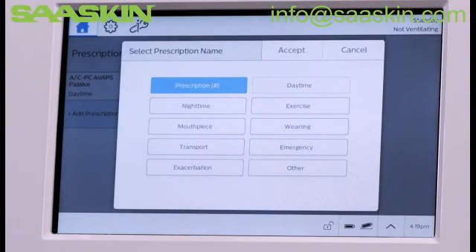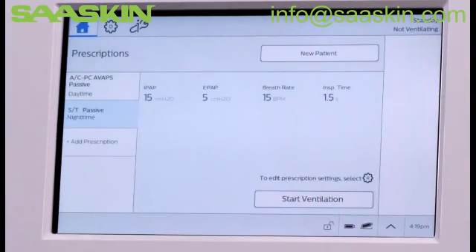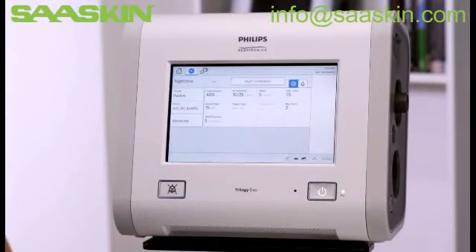Follow the on-screen prompts to choose a prescription name, such as Night Time, and use Settings to edit them. In this example, we'll make the same changes as before, but we'll turn Active Humidification on. When all necessary edits have been made, accepted, and the circuit attached, you then have two options to start therapy.